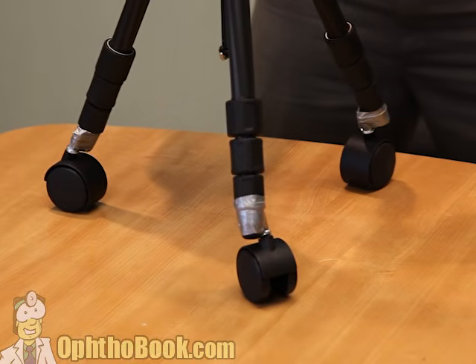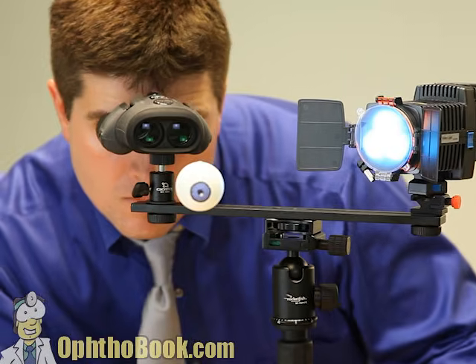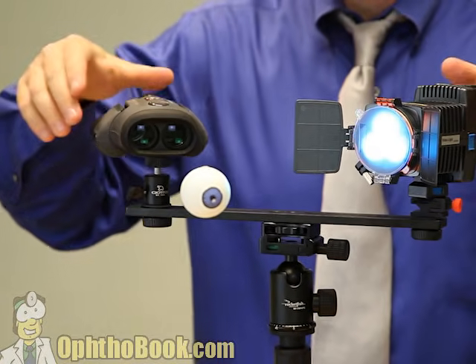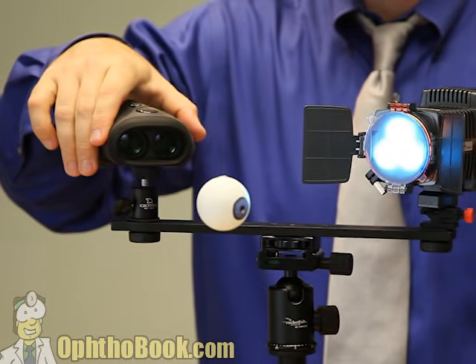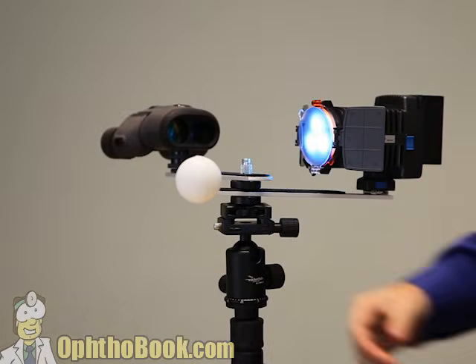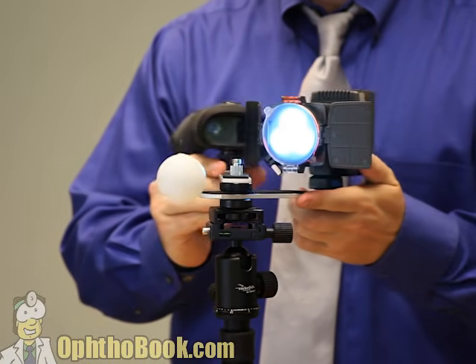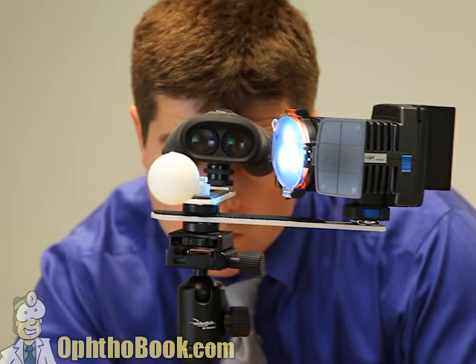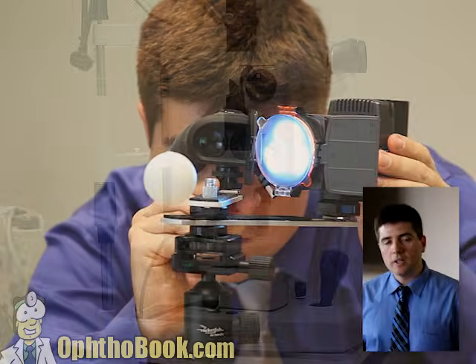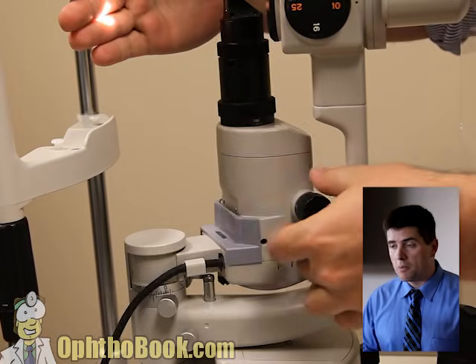And so now it moves around, and we can really move in and focus in on our eye. Now, the last thing we need to do is, right now our light is stuck. It can't move in relationship to our microscope. But what if we created some type of hinge mechanism so that we could move the light in relation to our scope and they still be in focus at the same point? This is basically the perfect modern microscope. And if we look at a modern microscope, this is exactly what we see. There's a microscopic component to it.